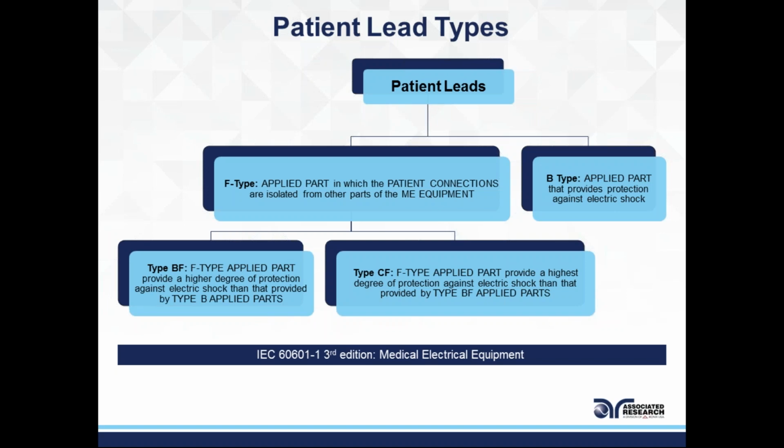So my example of EKG leads, for instance: if I have an EKG lead connected to me, I want to make sure nothing that comes out from the wall is ever coming towards the EKG leads, because if the insulation barriers I've put in are not in place or not properly in place, I could be in a potential shock hazard condition where anybody connected to those EKG leads could be shocked.